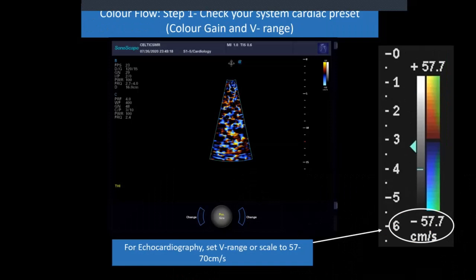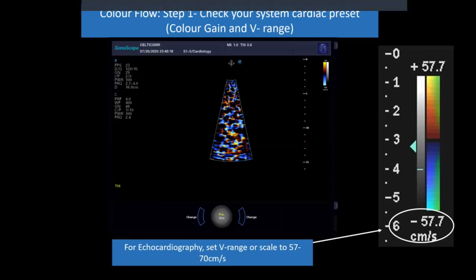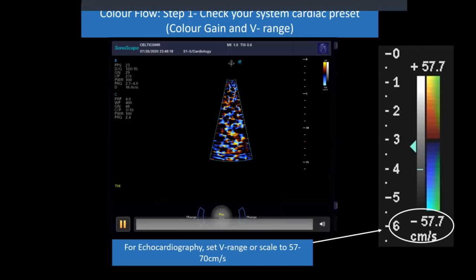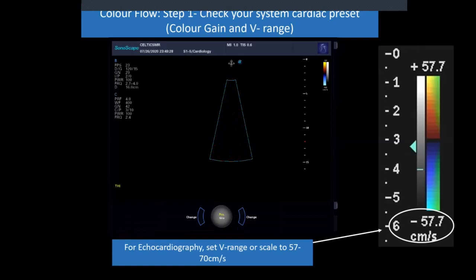Before you start with colour flow, have a look at what your cardiac preset looks like. When you press the colour flow button, the first thing to check is the velocity range. For cardiology, I'd set that somewhere between 57 and 70 centimetres per second. You'll find abdominal imaging presets are set for much lower velocity — maybe 19 cm/s — which would be inappropriate for cardiology. The next thing is where the colour gain is set. With the probe off the animal, turn the gain right up, then turn it down until that spontaneous speckling stops. That's roughly where you should be with your colour gain before getting started.